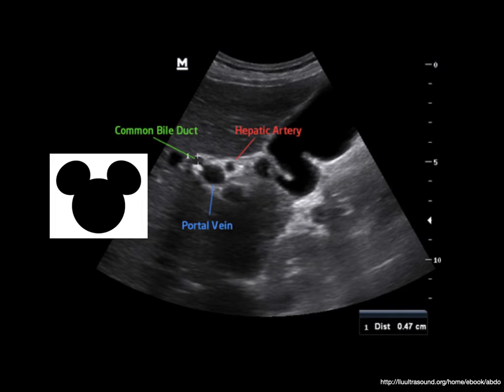Here's an example of a folded gallbladder where the neck is kind of serpentine. The MLF is super short but still bright white and points to the portal triad. And once you can identify the CBD, you're going to measure it from inner wall to inner wall. A normal CBD should be less than 6 millimeters, though we give seniors an additional millimeter per decade. So for a patient who is 82, they would be allowed an 8 millimeter CBD.